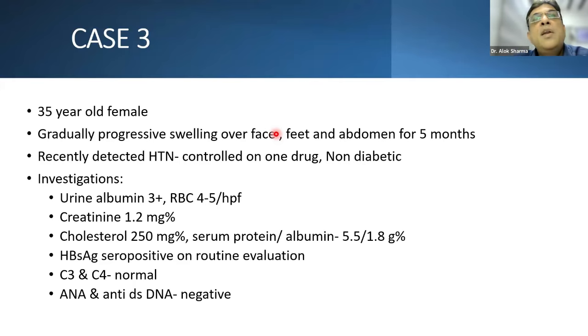These are just names. Remember, in renal pathology, it is all about patterns. It is not that if you call something segmental sclerosis, the clinician will start thinking of a different disease. Or if you add a focal or you delete a focal, the clinician will start thinking of a different disease. The important thing is you have communicated the pattern of injury, and the entire renal pathology revolves around patterns. So whatever I have spoken just now, or even in later slides, it's predominantly a pattern-based approach.